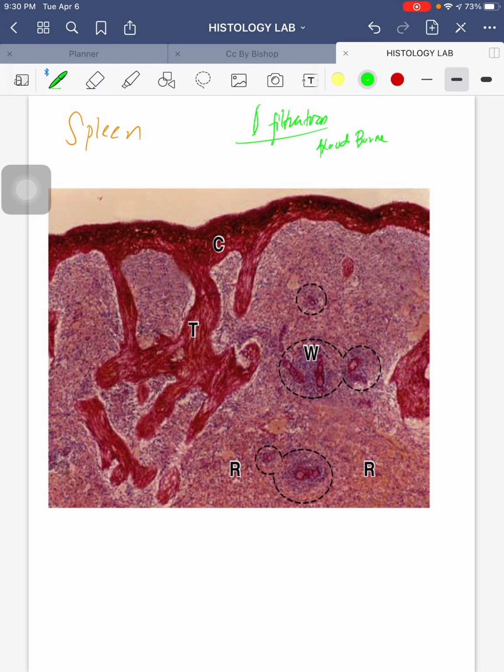Unlike the lymph node and the thymus, they don't have a direct role in blood per se. This one it has. Also, your spleen will still function in the production of antibodies, just like the others. By the way antigens are presented, to T lymphocytes, and then later on to B cells, to plasma cells, to antibodies. Okay, they still do that.